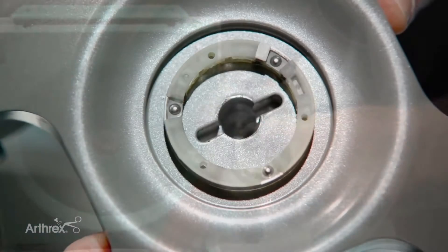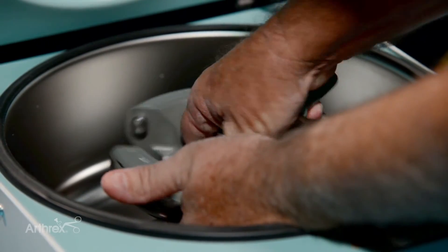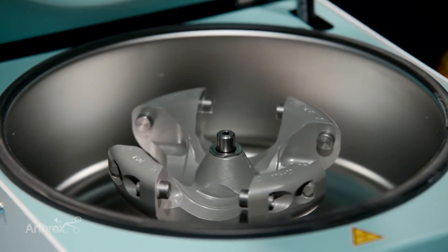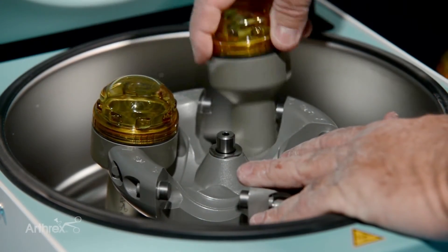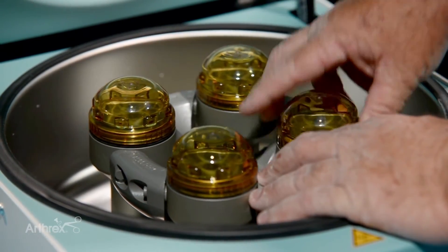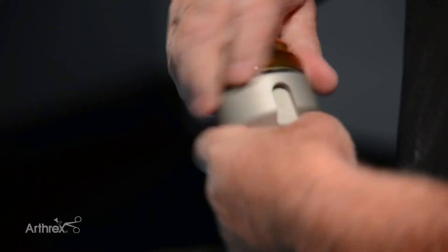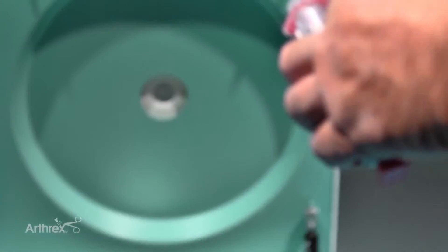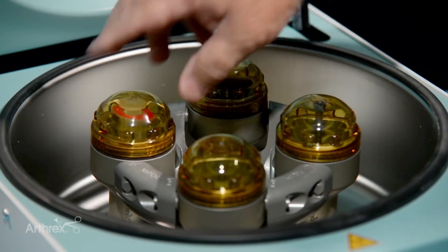We want to have this interface inside so that it fits properly. Then we introduce the buckets for the ACP — they're a swing-out rotor. It's four buckets depending on how many samples of ACP you have. If it's an odd number you're always going to have to counterbalance. In this case we have just one sample, so we take one of the buckets and put the counterbalance inside, put your product in the other swing-out, and set it to 1,300 RPMs for five minutes.